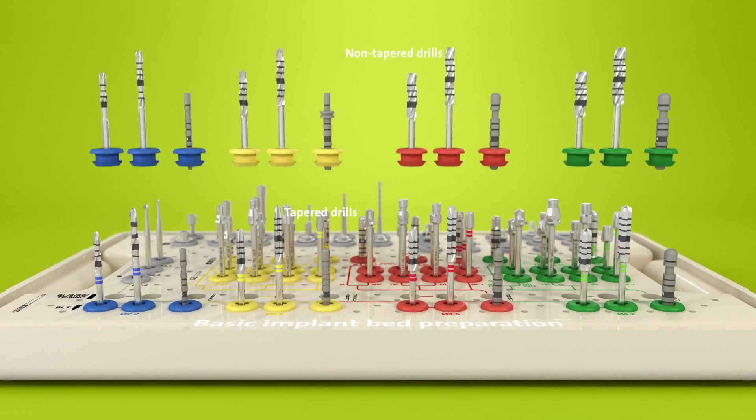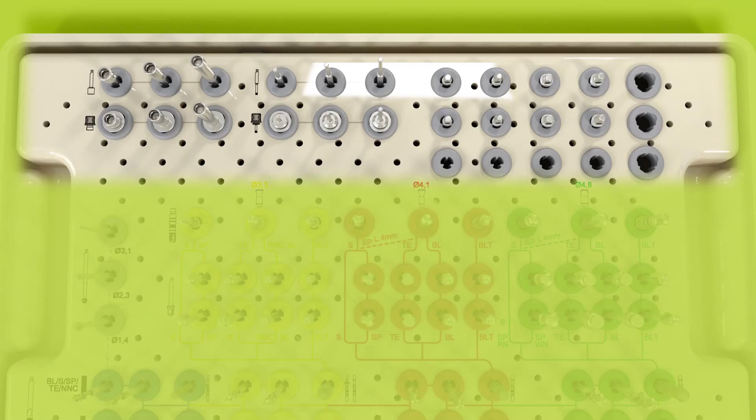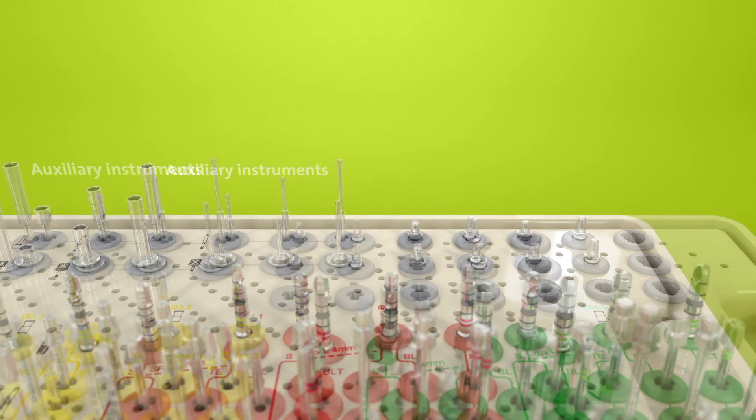The middle area contains all the instruments required for the fine implant bed preparation. These are profile drills and taps. In the upper part of the layout, in the grey inserts, one can find auxiliary instruments used for the implant insertion and the spare instrument holders.